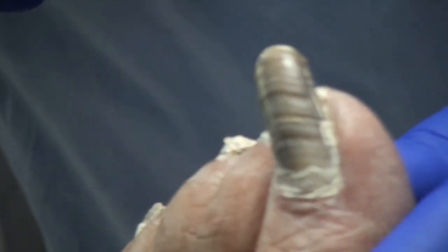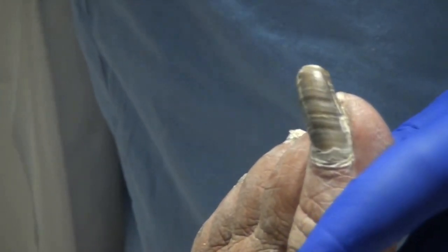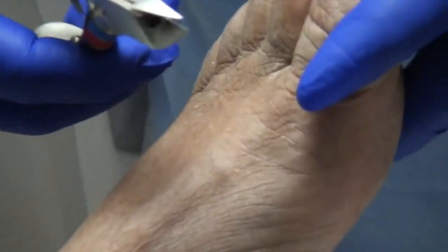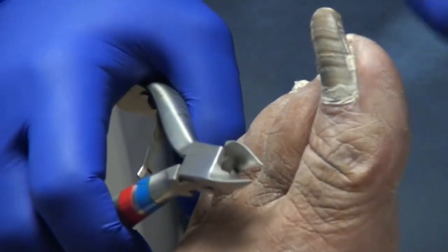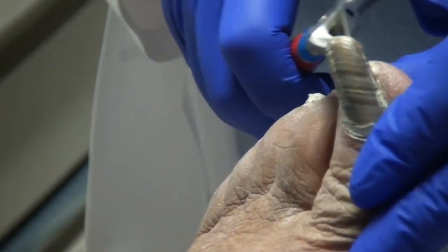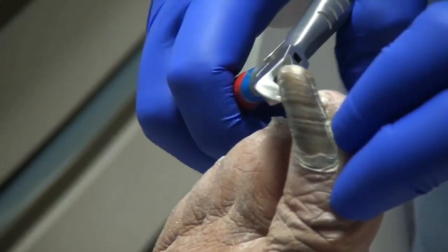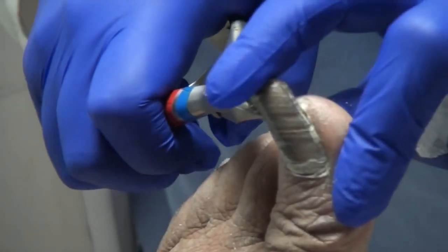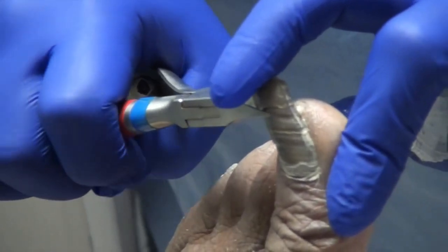I just can't orient myself to cut them straight across. So I'm going to show you how to do that. You may need to get a nail cutter like we have, because a regular flat one with a spring is never going to work on these. You need to have one where you can cut along the shape of the nail.